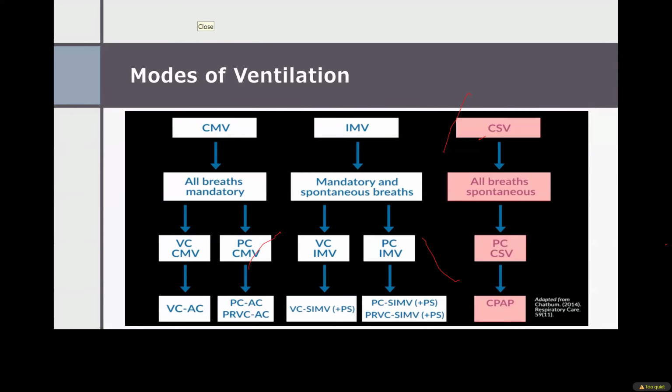What about high frequency ventilator? Do you have that high frequency ventilator? Is it part of that Leone machine or something different? So it's part of the Leone. And do you use high frequency oscillator or a jet? Oscillator. Okay, so that's good.